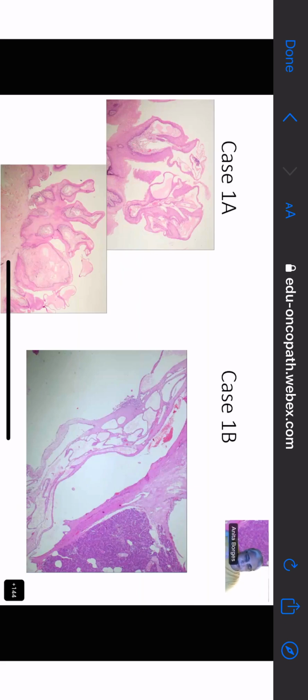Suveta? Yes, ma'am. To get an approach to the diagnosis so that we can differentiate the lesions. Very good. So now I asked Dia, she said something about congested blood vessels. Dia, you were talking about some little congestion over here. See, I marked it.